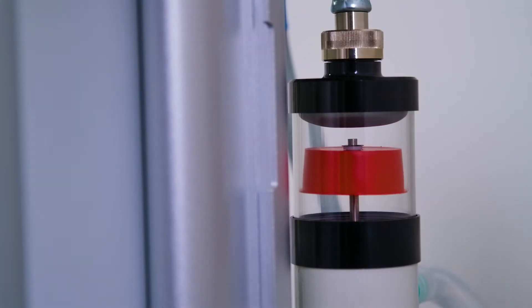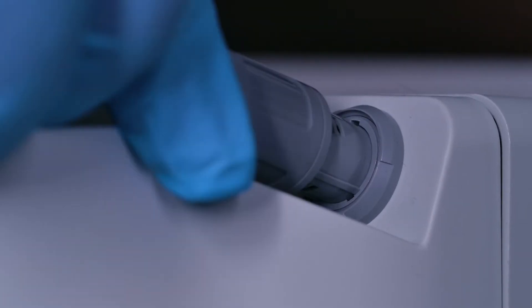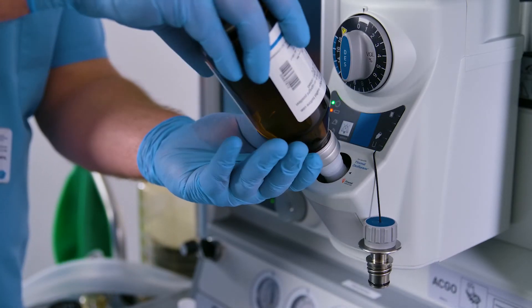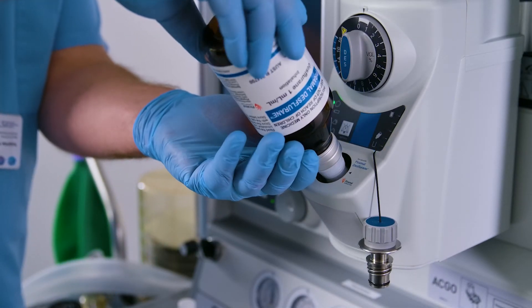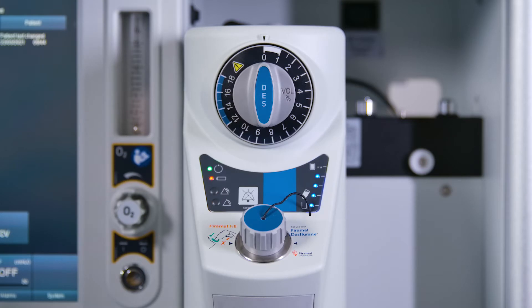Mount the vaporizer on an anesthetic machine equipped with an anesthetic gas scavenging receiver. Connect the electrical power supply cable. Fill the vaporizer with desflurane. Allow the vaporizer to finish warming up and enter standby mode. This is indicated by the power indicator being continuously illuminated.